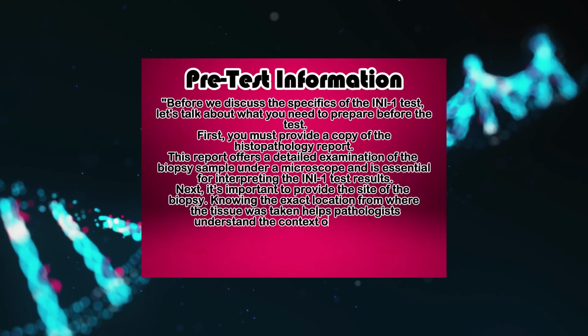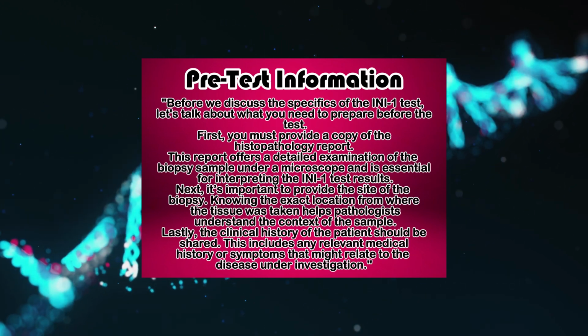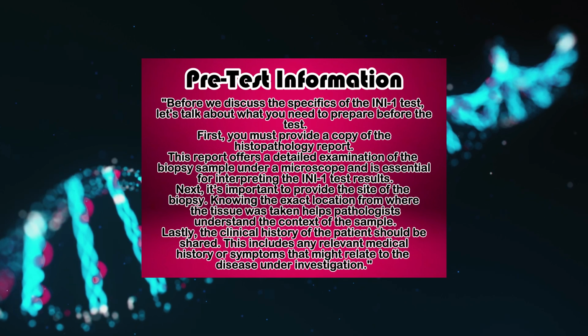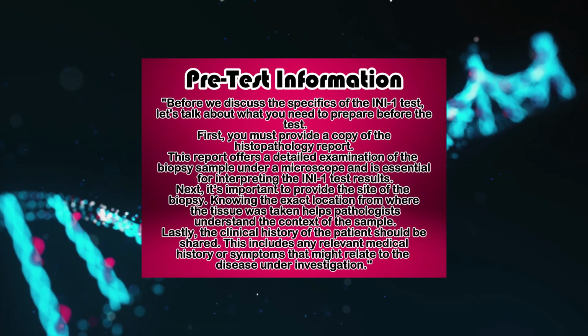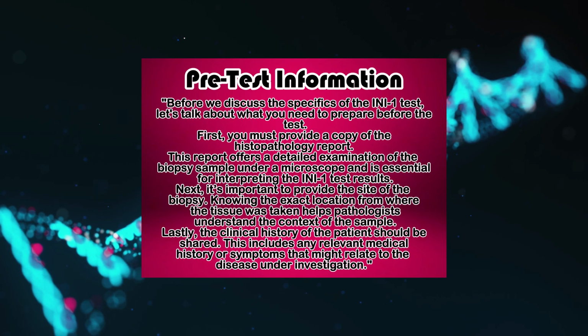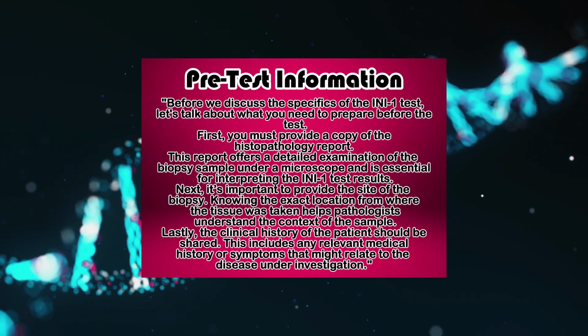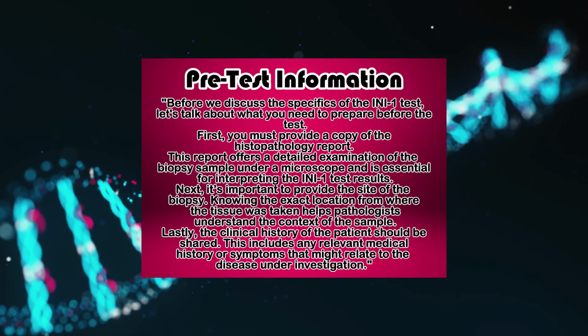Pre-test information. Before we discuss the specifics of the INI-1 test, let's talk about what you need to prepare before the test. First, you must provide a copy of the histopathology report. This report offers a detailed examination of the biopsy sample under a microscope and is essential for interpreting the INI-1 test results.